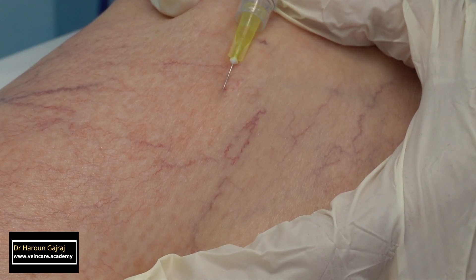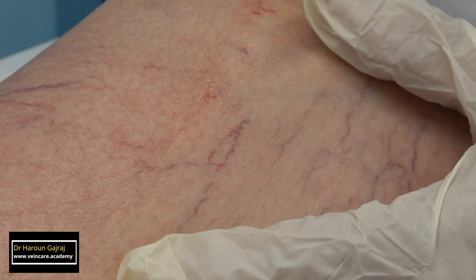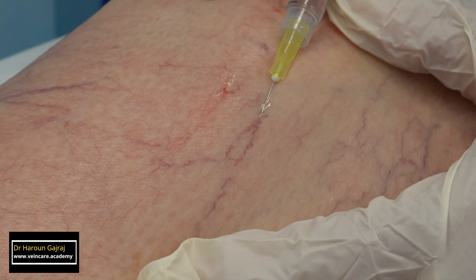Successful intravenous injection results in blanching along the course of the thread vein. Blanch no more than a 2 cm by 2 cm area of telangiectasias at a time, because the solution is most active close to the injection site.